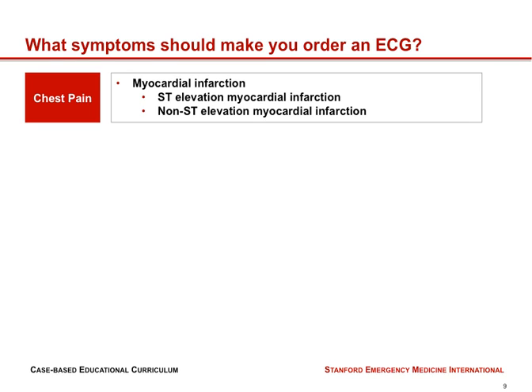So please ask them two questions. Are you having chest pain, and are you having chest pressure or tightness? If you ask the question in this way, you'll get all of the patients with chest pain to tell you that they have it. If you don't, you may miss a few. And that's dangerous because some patients with chest pain, of course, are having myocardial infarctions.